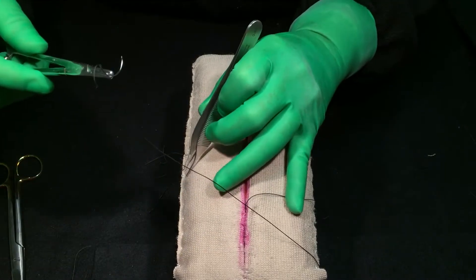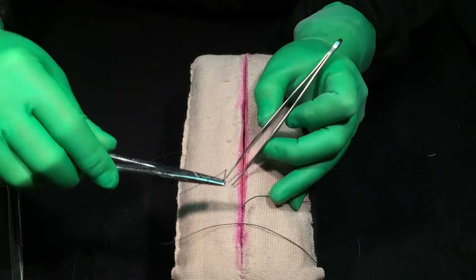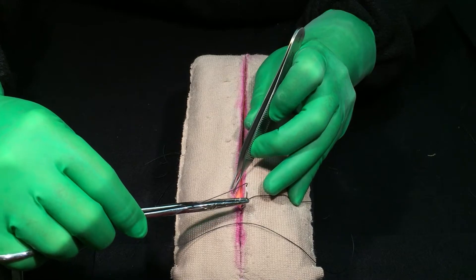Alright, so if you notice my left hand with my forceps — my pinky, my index finger, or both — are going to be holding that suture out of my way while I suture. You need to suture right close to the skin edge.